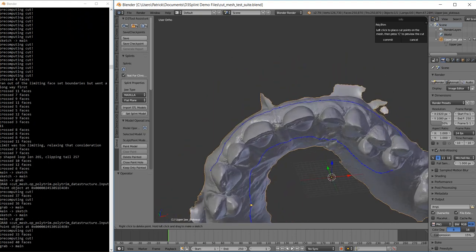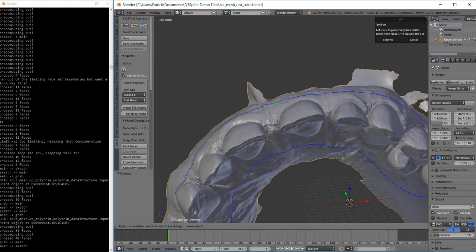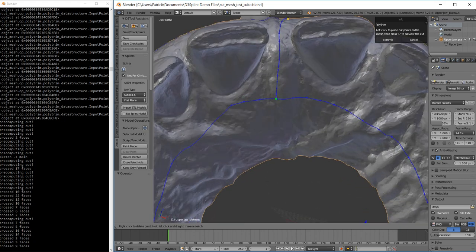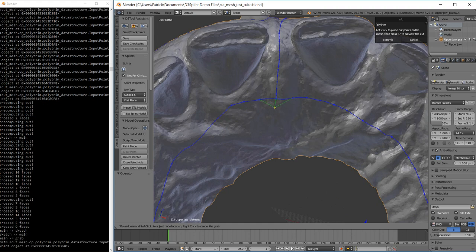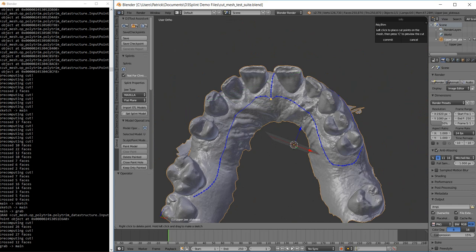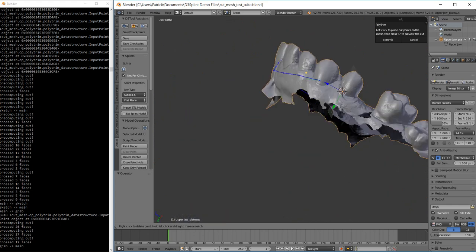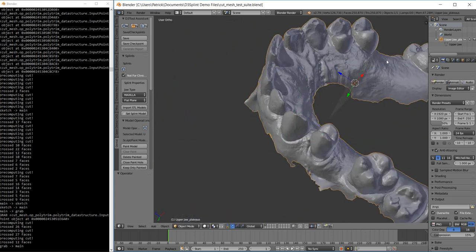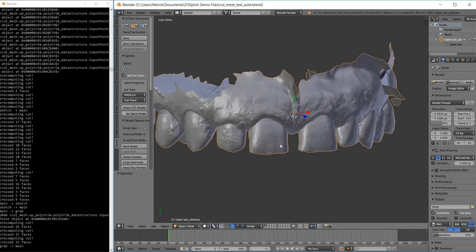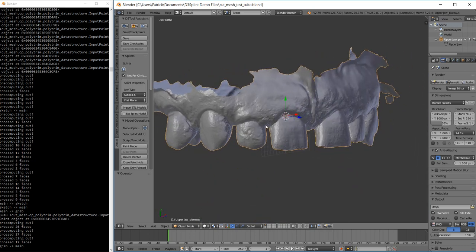What's neat about this is later we'll be able to have multiple cuts, where you end up cutting this on a network. For example, if you were sectioning a bunch of teeth for, I don't know, some kind of tooth movement application.